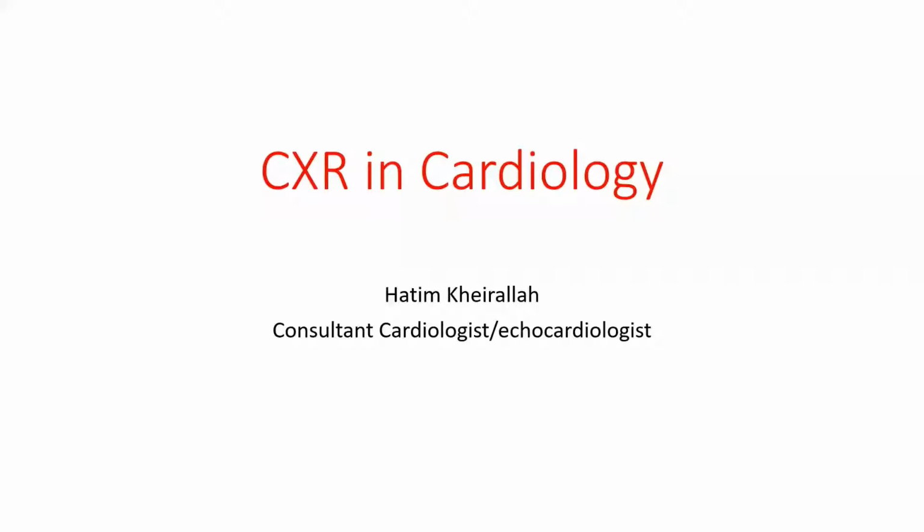Chest X-ray in cardiology used to be the first lecture in previous years. It's a bit of a difficult topic because we always give the chest X-ray a quick glance, mainly for congestion, pleural effusion, and sometimes the size of the heart.